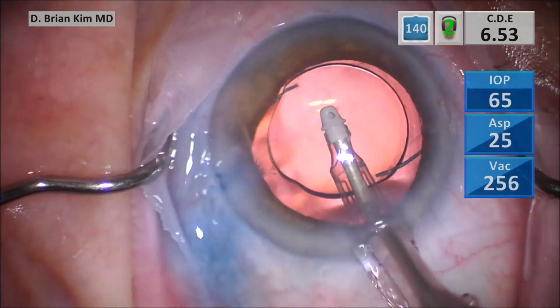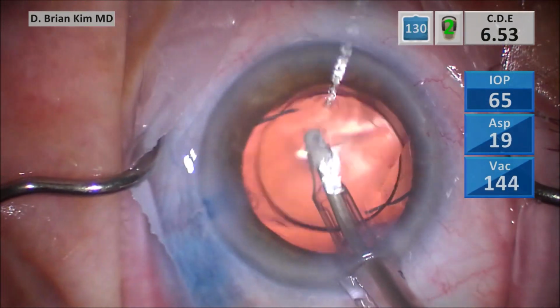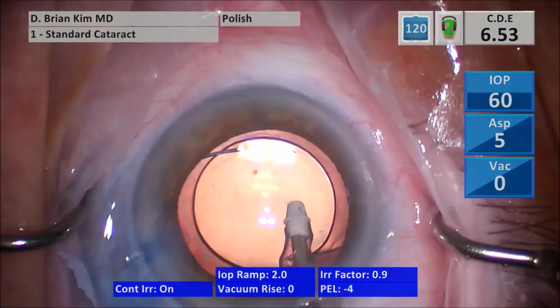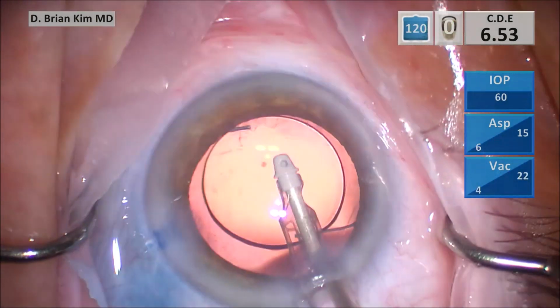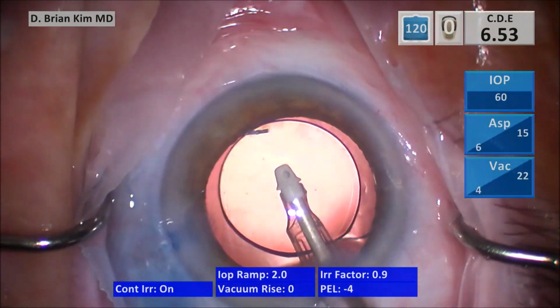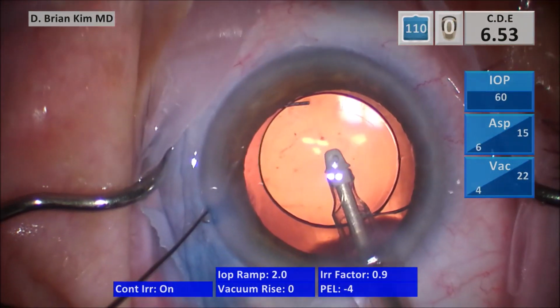So you can see this is a very dense lens, a hypermature lens. My CDE was 6.53, fairly little use of the ultrasonic energy in this hypermature lens. You saw that there were very dense leathery posterior adhesions throughout the case. I had to perform multiple mechanical fracturing maneuvers.